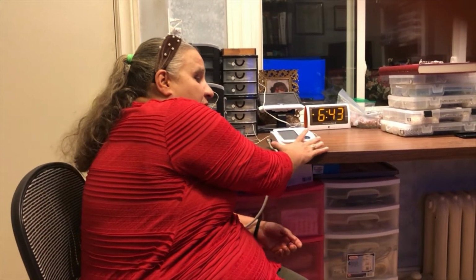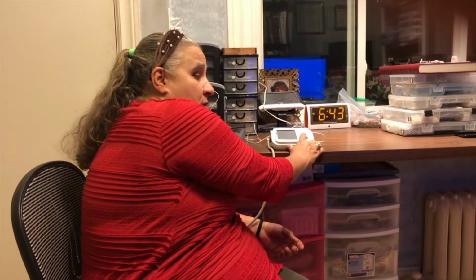So now, I've got the cuff on. I'm going to press start. So now you guys are finally going to get me to shut up, because I can't talk while this is working. So I'm going to press it and I'm going to shut up. Please sit down. Preparing to take measurement. Please do not talk or move.